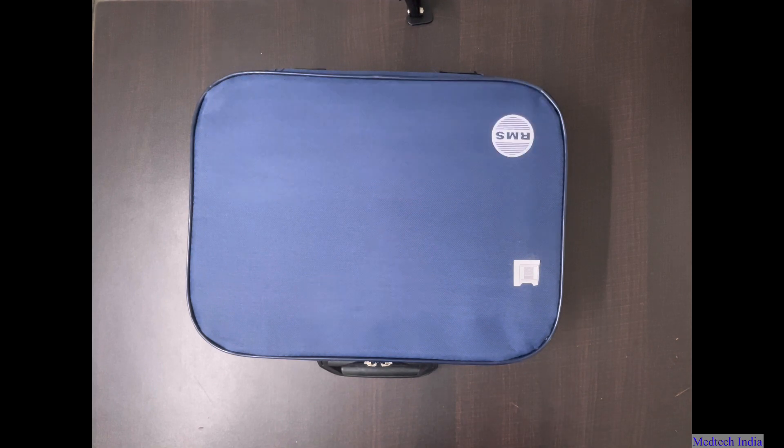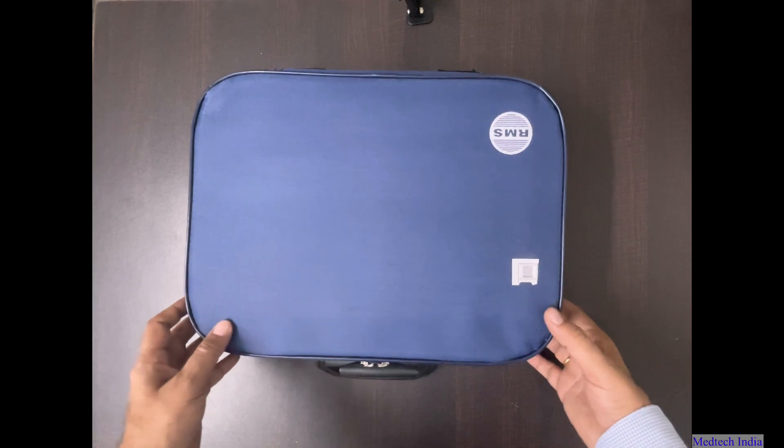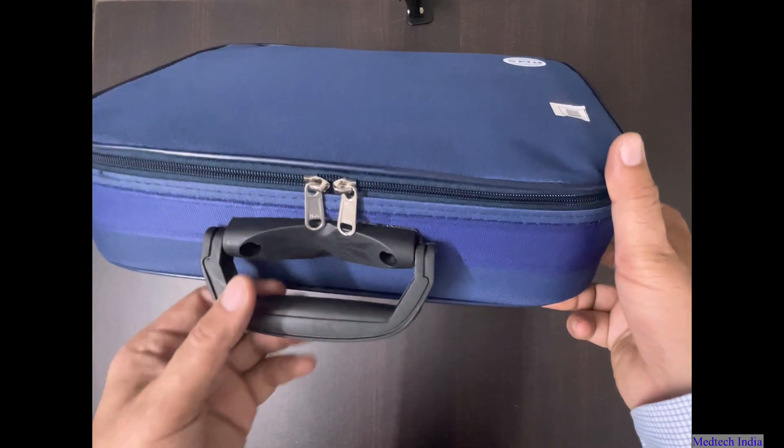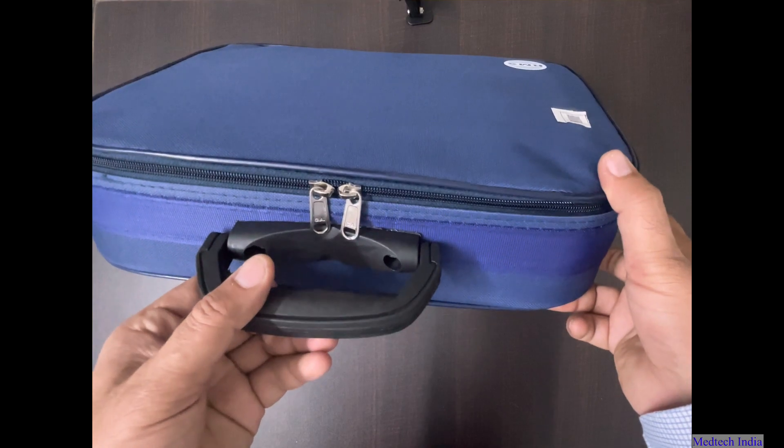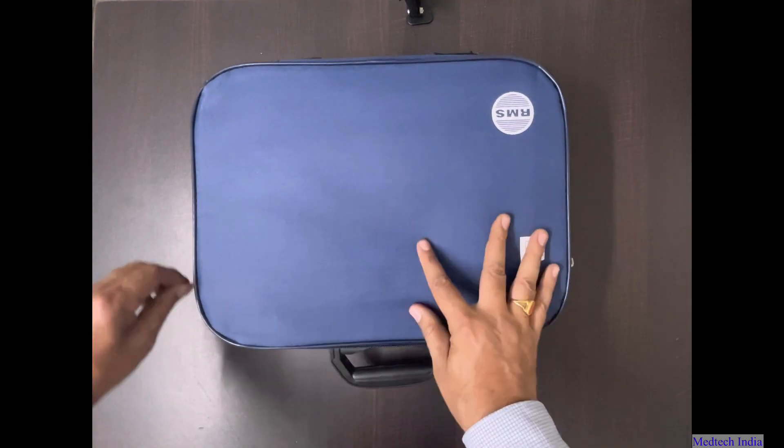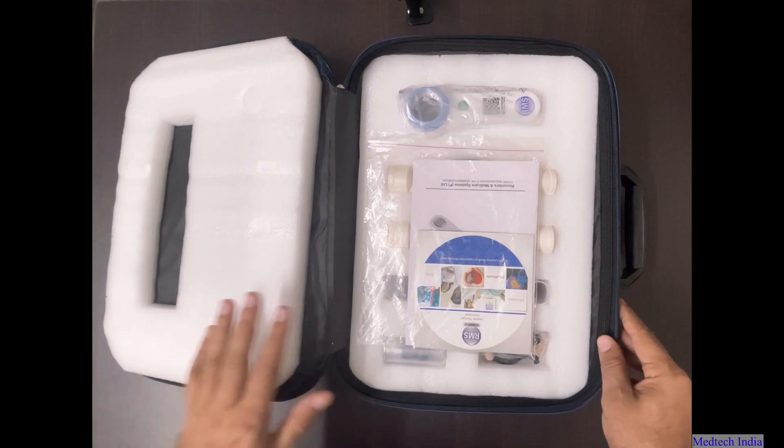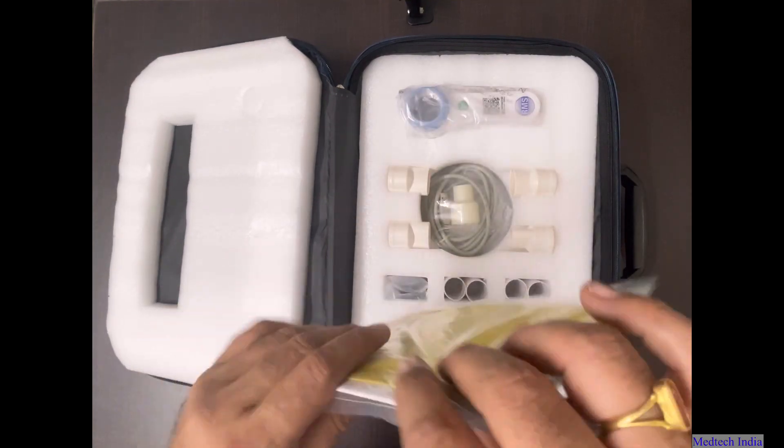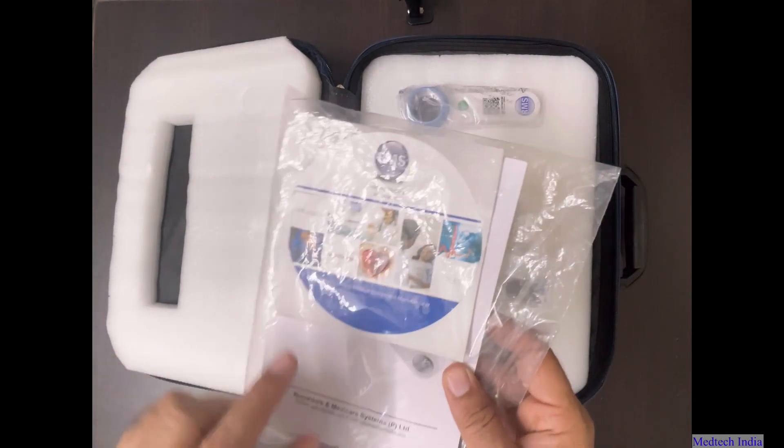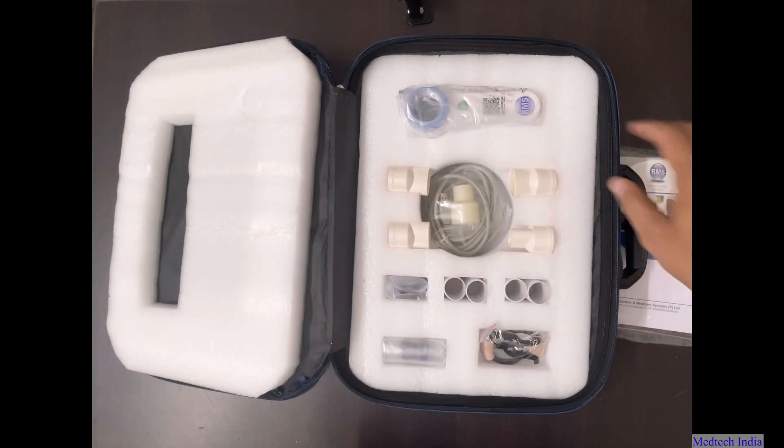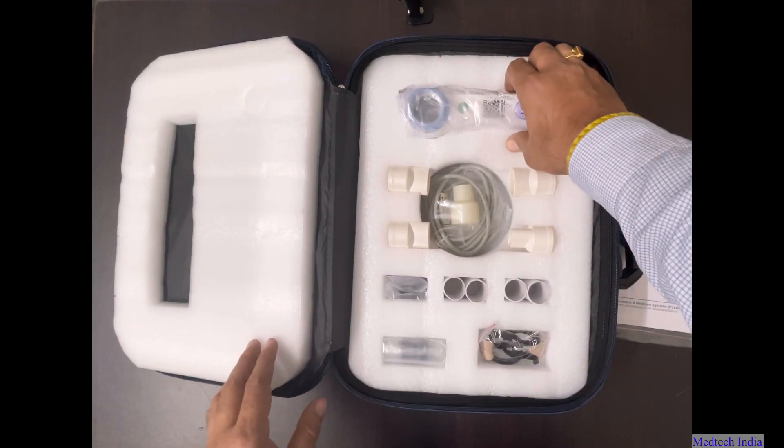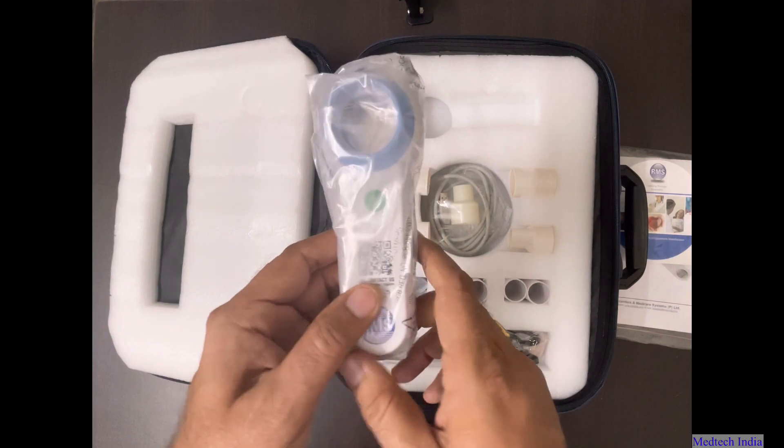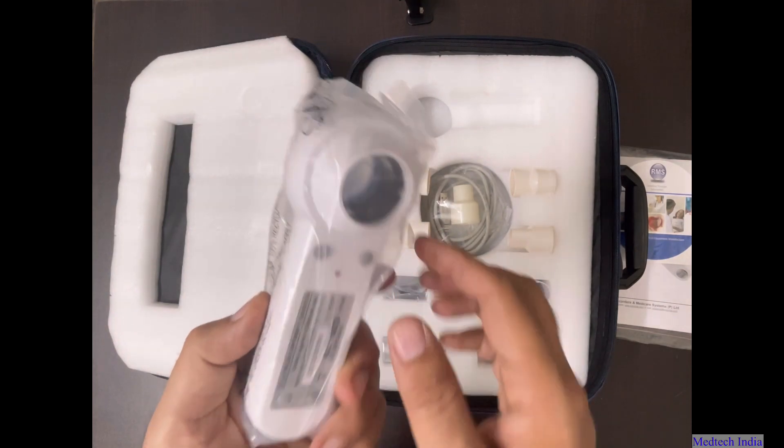The company provides blue color bag along with this device. It's easy to carry machine safely inside this bag. Now we will open this bag. After opening the bag, we will get one software CD along with that user manual. Next is Helios 401 handset.